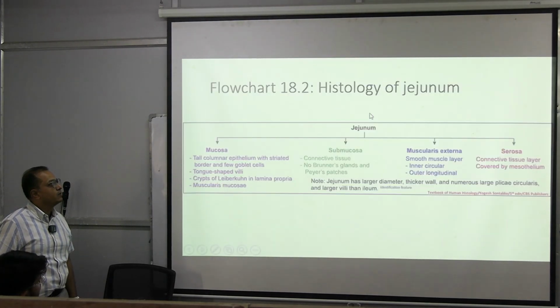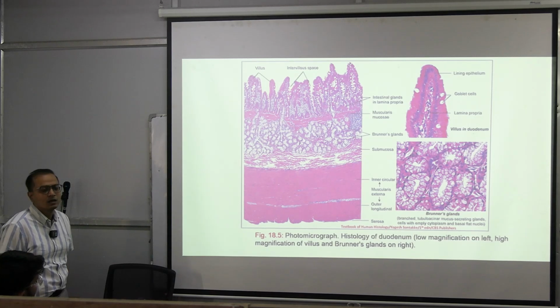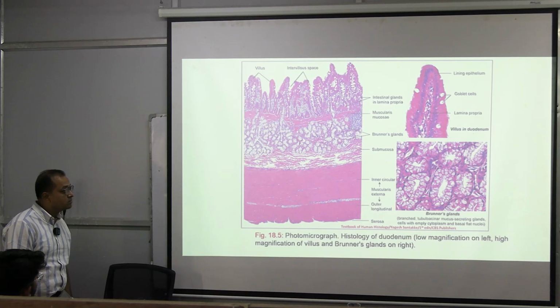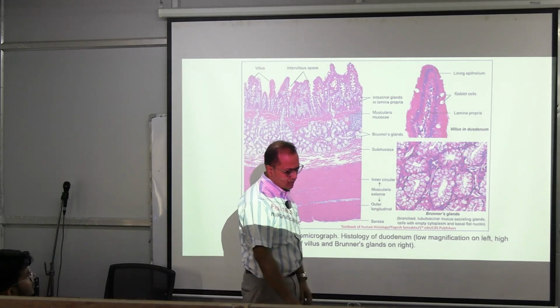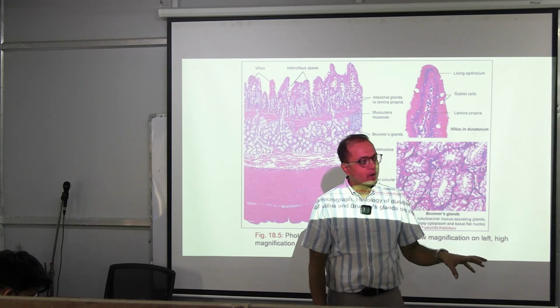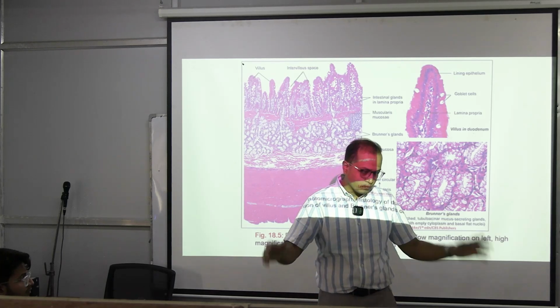The hallmark is that we identify the finger-like projections present in this segment. We should be looking like this, and if you find some glandular collection like this, it should belong to the duodenum. If you do not see anything, that basically means jejunum, and if you can see some of these lymphoid aggregates, that is likely to be the ileum specimen. But even having said all this, if you fail to identify the subsegment of the small intestine, do not bother. Just identify the small intestine with this feature and have a grasp on it. Later on you can separate it out, it is good, rather super good.